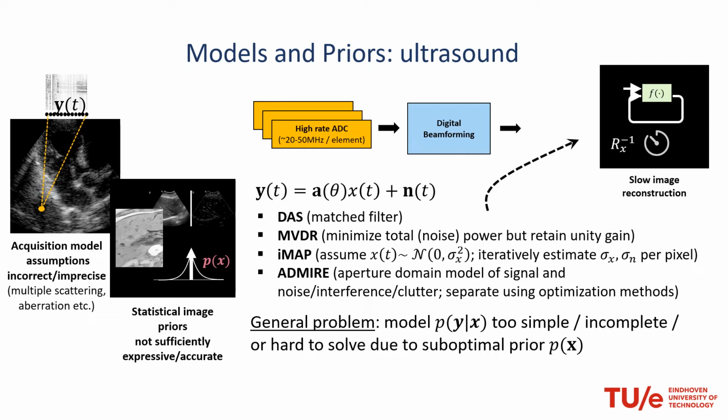And imagine doing this for a matrix transducer, which has a two-dimensional set of array elements that can easily be something like over 1,000 elements. Then that is extremely slow, and you have to do this for every pixel in pixel-based beamforming. Yes, because you're locally finding the optimal filter for every pixel.